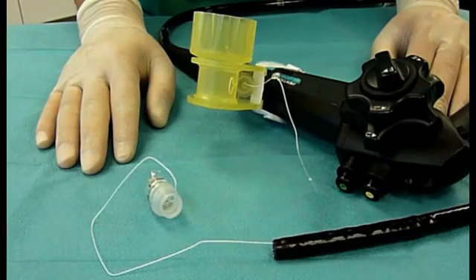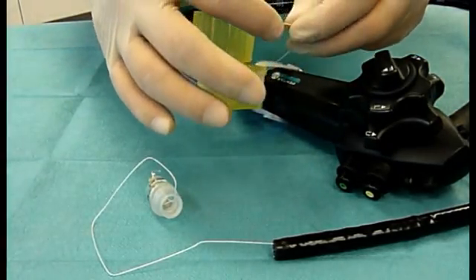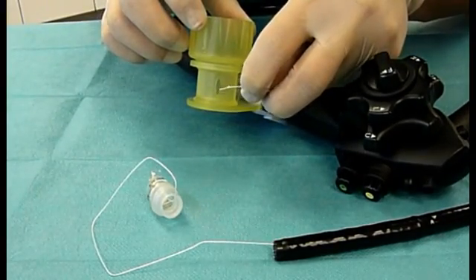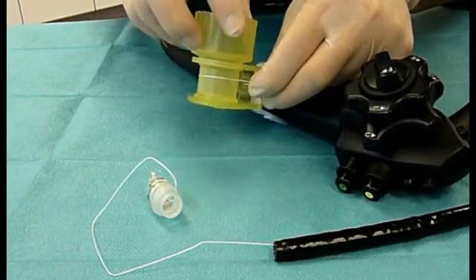The thread is attached to the OTSC handwheel by clamping it in the corresponding gap. By turning the handwheel away from the endoscope's handle, the thread is wound up.